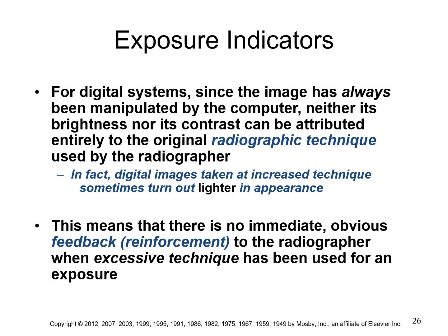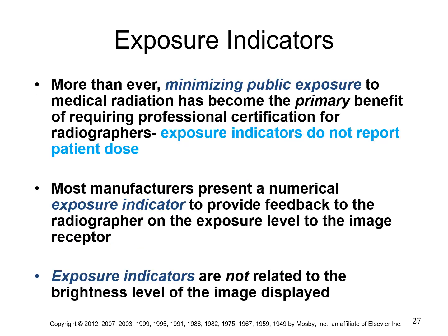Now steps are being taken to educate technologists, and we make it a point to keep reinforcing what exposure indices are for and why we have them. Okay? More than ever, minimizing public exposure to medical radiation has become the primary benefit of requiring professional certification for radiographers.